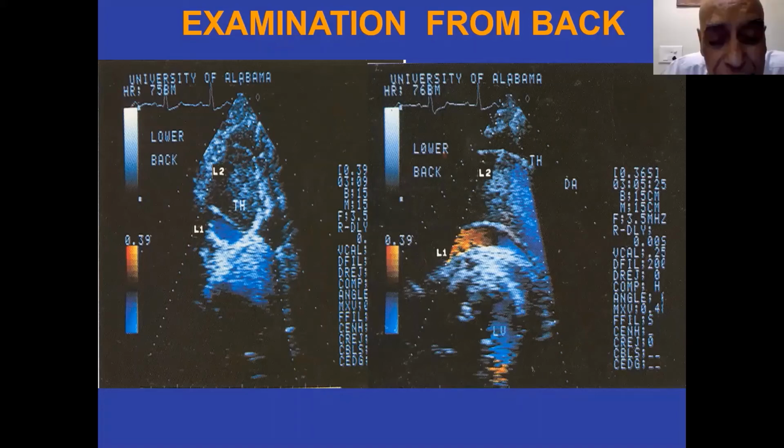So when you get the apical four-chamber, you know the index mark is at 4 o'clock, and you're right at the apex. So you go slightly above the apex, number one. Number two, slightly rotate toward the two-chamber, but not quite two-chamber. So you rotate from the 4 o'clock to the 3 o'clock position. And then you angulate the beam down till you eliminate the atria completely. And when you eliminate the atria completely, you'll get the biventricular view.